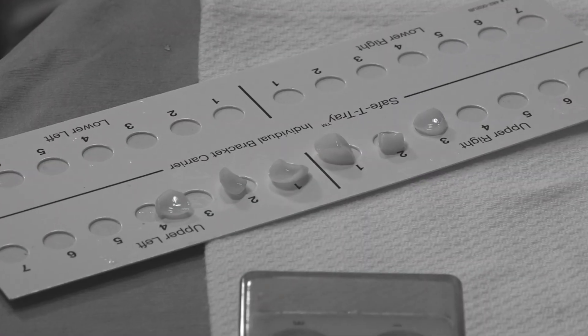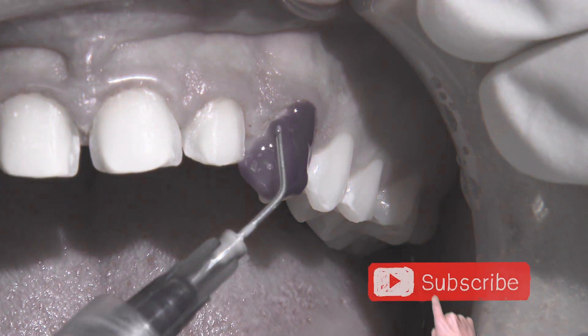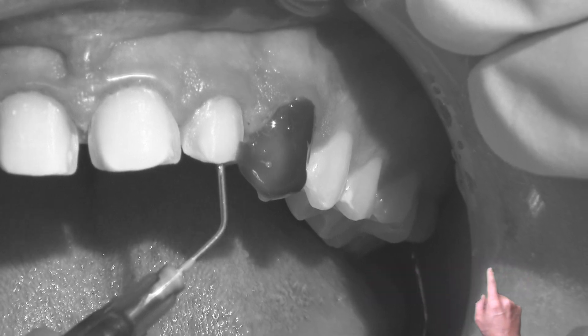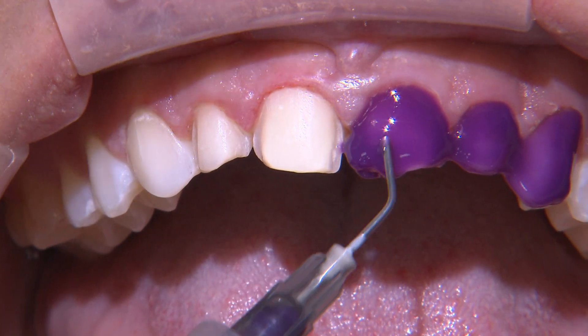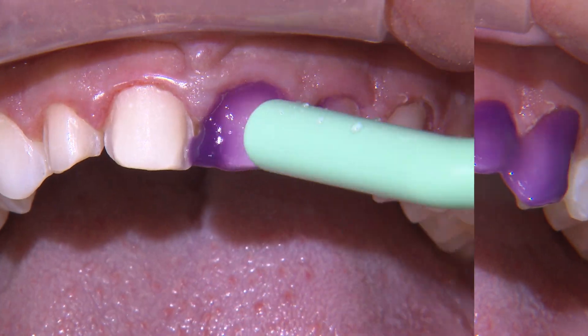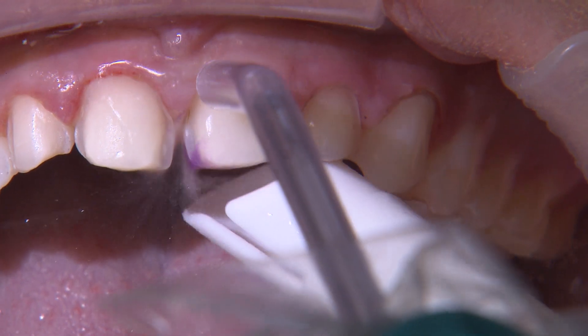Now it's time to prep the teeth. I always use a total etch or etch and rinse protocol. I apply phosphoric acid to the entire tooth surface for about 20 seconds and then rinse away. This to me is still the best way to establish a strong bond to tooth structure.